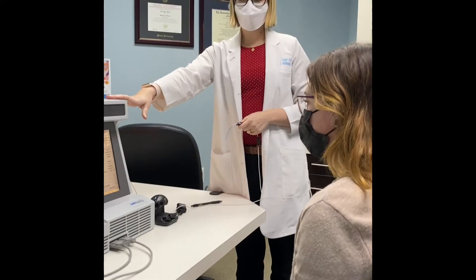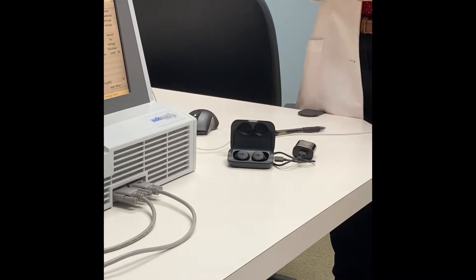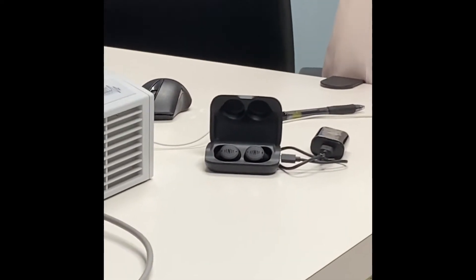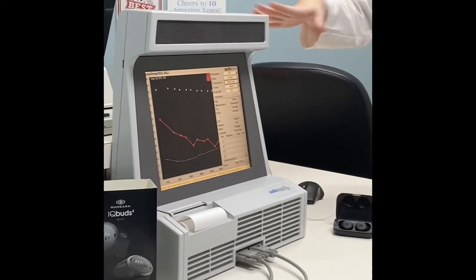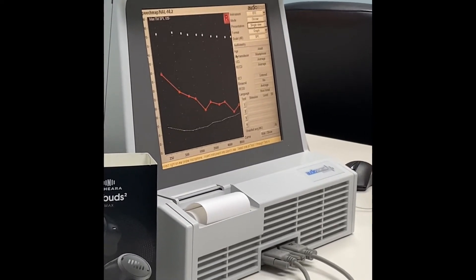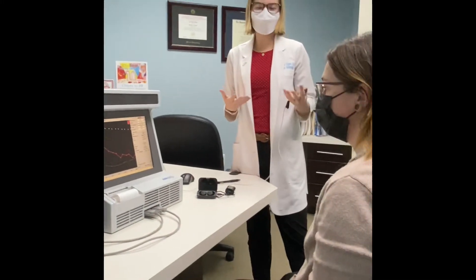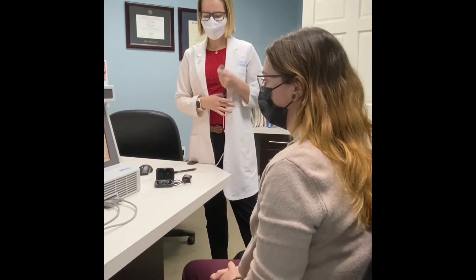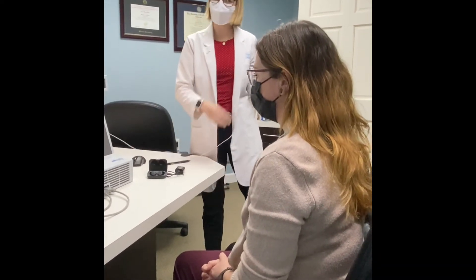What we are going to do today is use these Nuheera IQ Buds — some of the most popular sound amplifiers right now — and we are going to use real ear measurement to see exactly what they're doing, and if they are providing adequate prescriptive sound for what Nathalie is missing. Because her hearing is worse in her right ear, that's what we're going to start with.